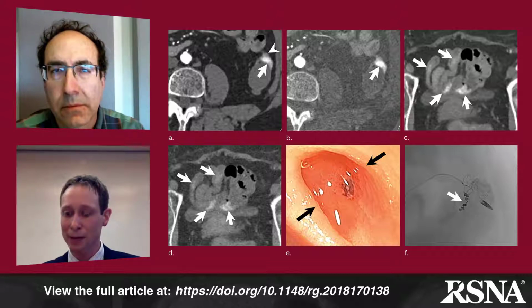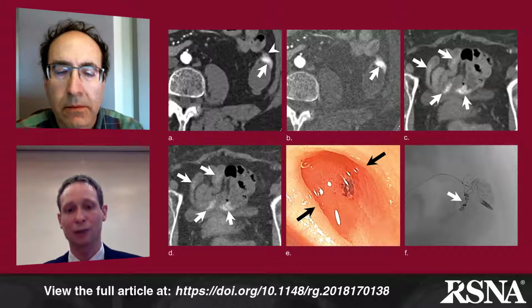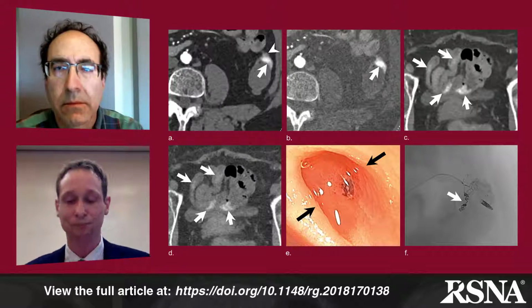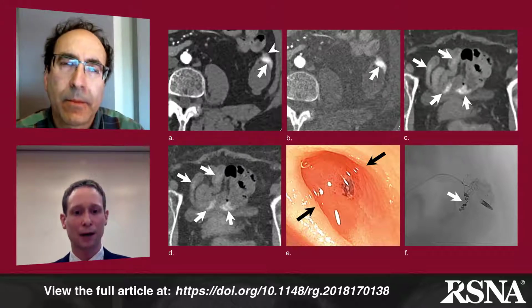In that same patient, here in part C, we see again high attenuation material within the lumen of the small bowel. Comparing with a virtual non-contrast scan in part D, that material persists. And so that's non-iodine containing, just foreign material, and it's an incidental finding, not active extravasation. This patient went on to get a colon prep and colonoscopy.